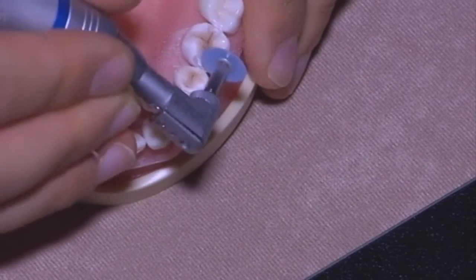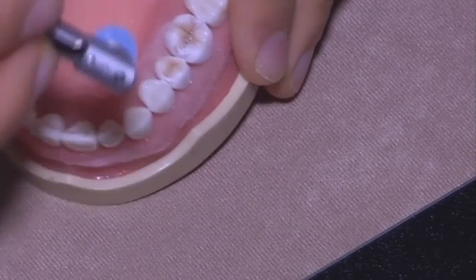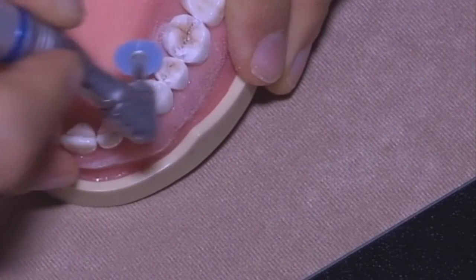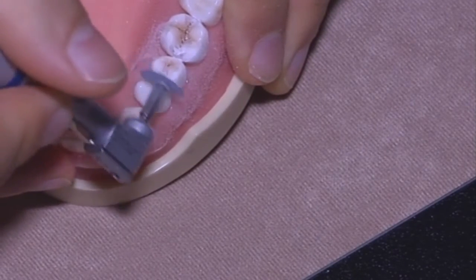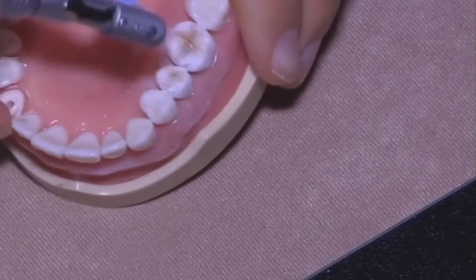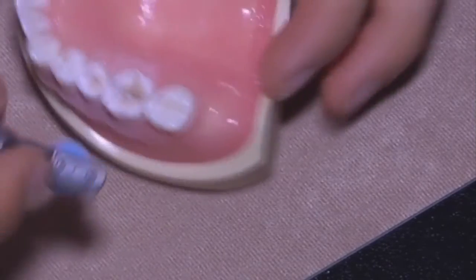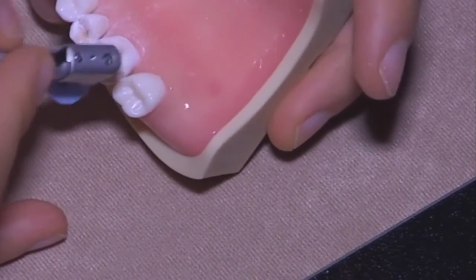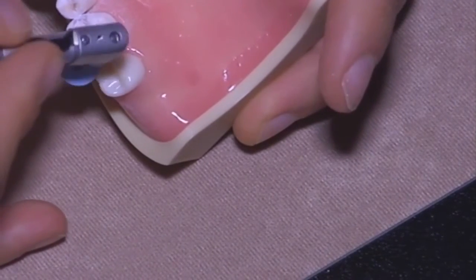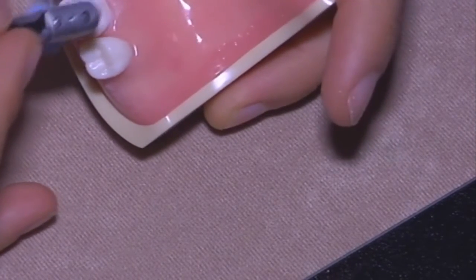That's why the handpiece must work slowly. You don't have to have a full pressure on your foot control, otherwise you're gonna open the contact point. And this is the only thing that patients understand on their posterior restorations, if the floss goes within the contact point.